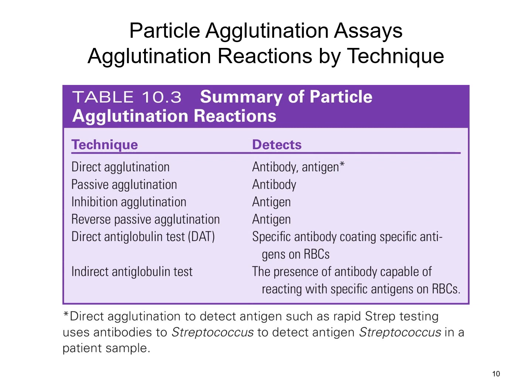Some of your other methods, you'll learn a little more about as we progress through this course, as well as when we get into our immunohematology blood bank course, especially with these test methods, a direct antiglobulin test versus an indirect antiglobulin test. You're looking for something specific in each of these. With your DAT, you are looking for specific antibodies that are coating the patient's red cells, whereas in the indirect, we're looking for the presence of particular antibodies that are capable of binding some kind of red cell.